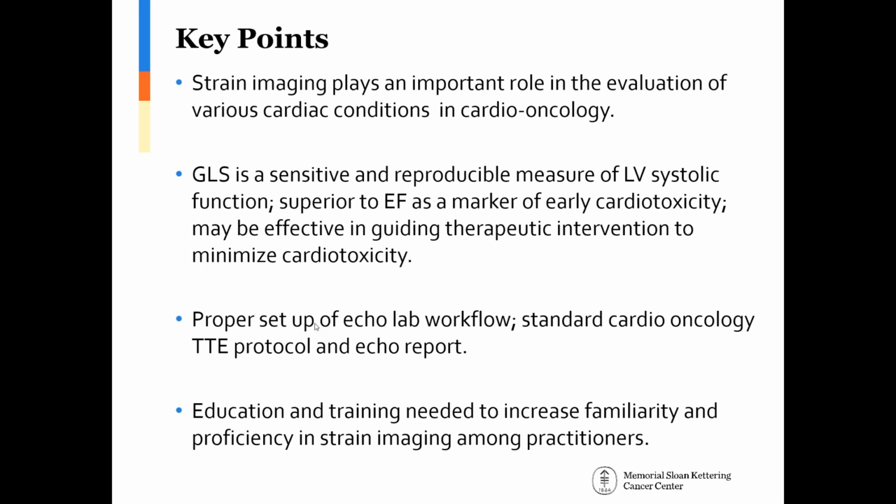Right, good. I think Dinesh and I actually had this conversation. In our laboratory, we do strain for clinical studies, and the numbers are quite high. So I don't have 1 or 2 sonographers doing this; I have all 8 sonographers doing this. And absolutely there's a difference in expertise and competence in doing strain.